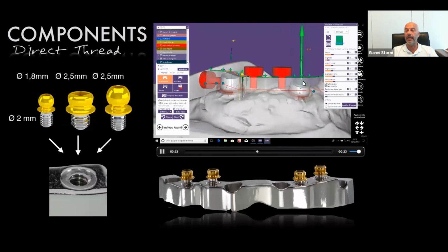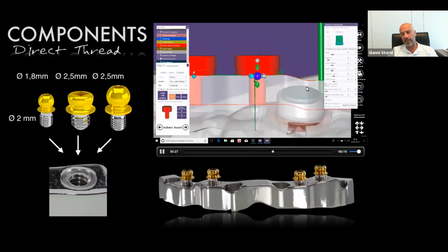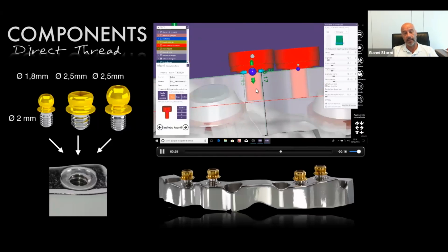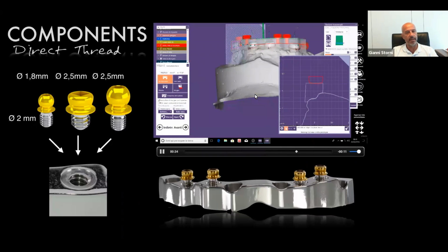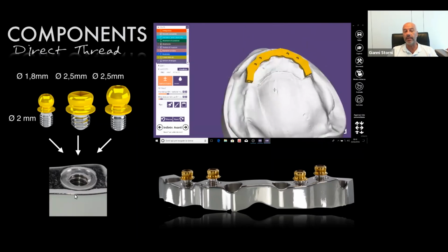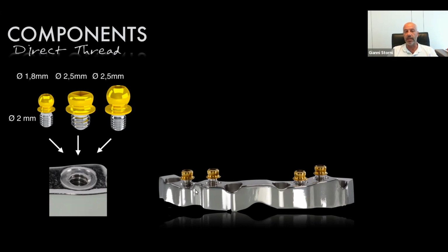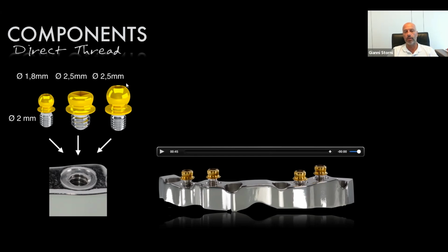If you don't find it, you can ask Fluorodental to send the file to position and mill, because in this case the software and the machine already thread the bar with a 2 millimeter thread. Then we only have to screw in the attachment you choose: micro, Equator, or 2.5 ball. So you have a wide range of possibilities.